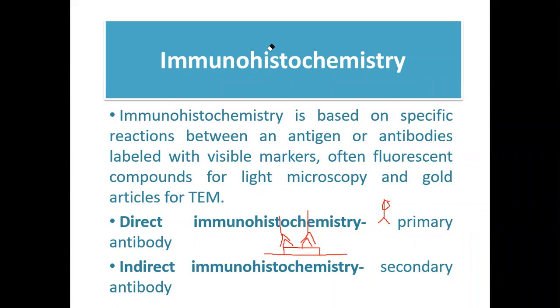So they will bind now dun sa kanilang Fab region. So guys, if this is your antibody pala, ito yung tinatawag natin guys na Fab region. Okay, ito, yung parang pinakaulo niya. This is the Fab region or the fragment antigen binding. Hold on. Nawala tuloy.